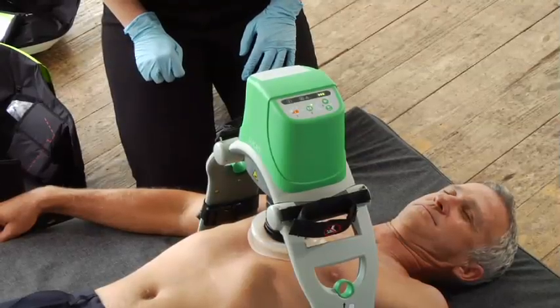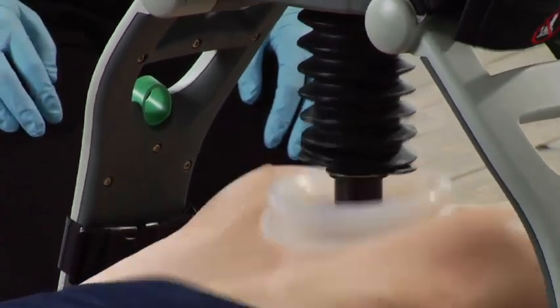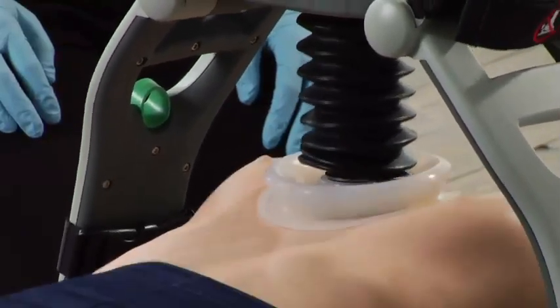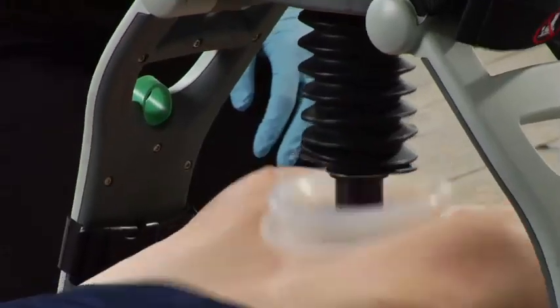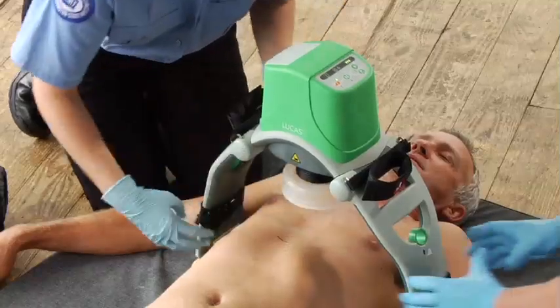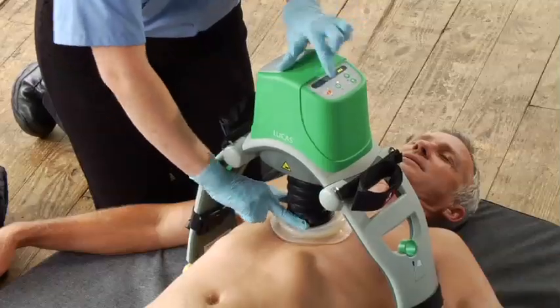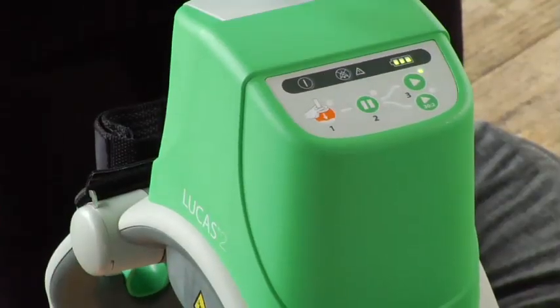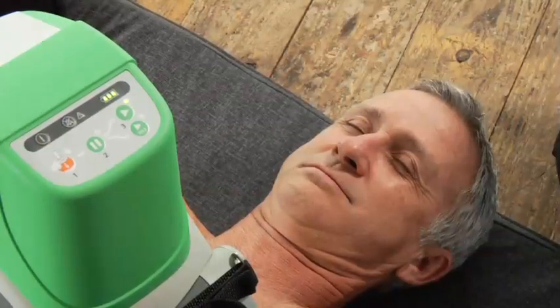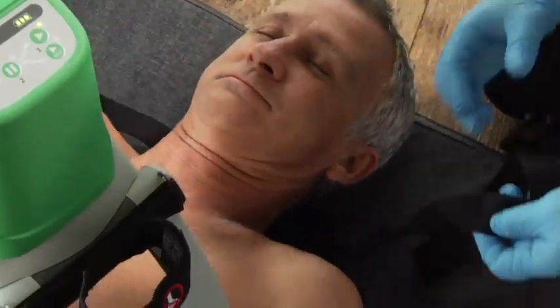So let's do some compressions. Push the active button and there it goes. If you need to reposition Lucas, make all adjustments as quickly as you can. Pause Lucas and go to adjust mode. Adjust the position, reset the pressure pad — hold it there while you press pause to set that position. Then push the active button to resume compressions.